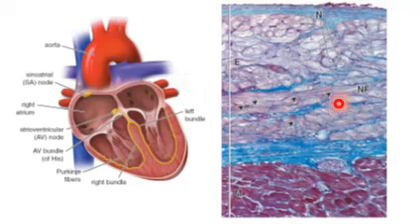Again, we can observe this is a nerve fiber. Of course, this nerve fiber belongs to the autonomic nervous system. It supplies the heart, and of course the sympathetic accelerates the rate of the heart and enforces the force of contraction, and the parasympathetic delays the rate of the heart.